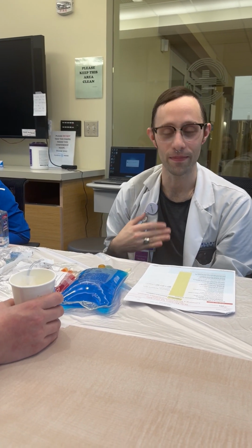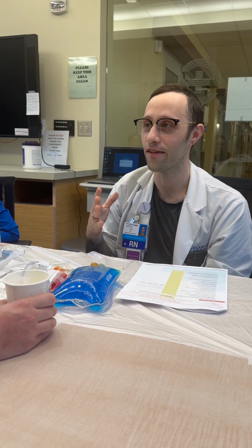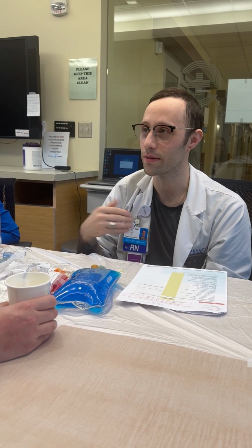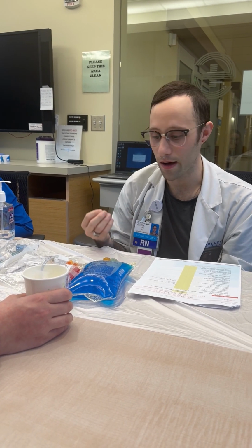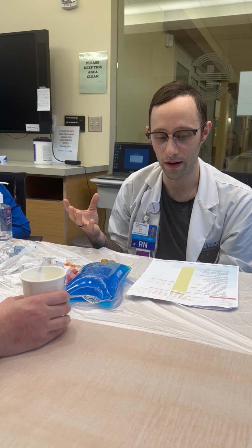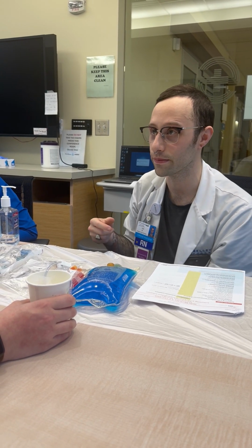All right, so I'm back to see my patient Gabby. It's an hour after I gave the ondansetron. How are you feeling, by the way? Great, not nauseous anymore. Oh, perfect. Okay. We actually have some IV fluids for you, and also something to treat your infection.